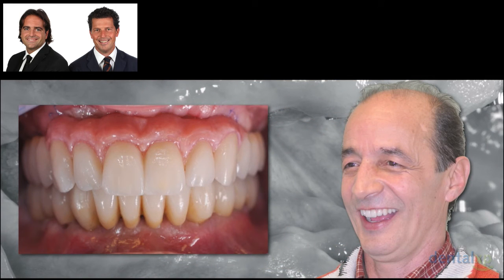Here is 24 hours after the surgery. You can see in the intraoral picture that the stitches are still in the mouth of Sergio, but in the right picture you can see Sergio smiling, and he had no pain.